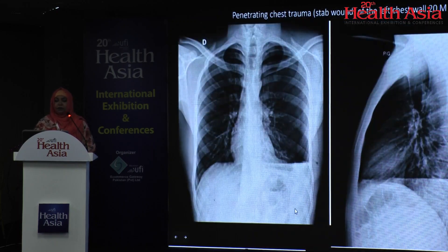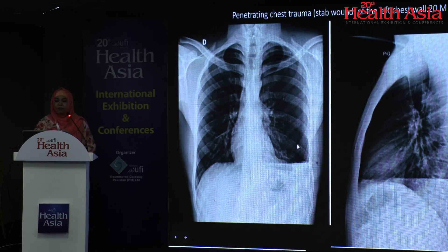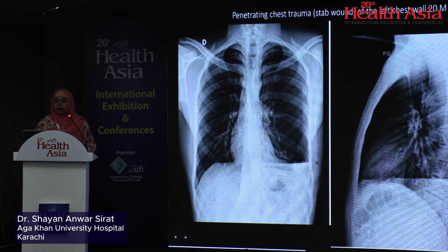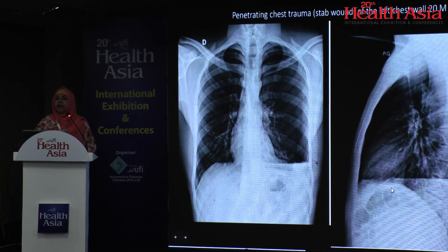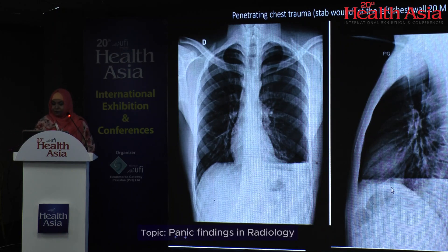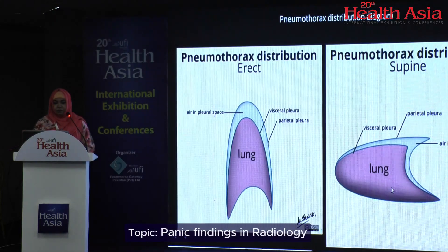Another example: a post-traumatic patient. Here you can see a fluid level and you can see the visceral pleura, making a hydropneumothorax. You can confirm this on your lateral radiograph — it shows an air-fluid level with no meniscus sign and the fluid is not tracking along the pleura.